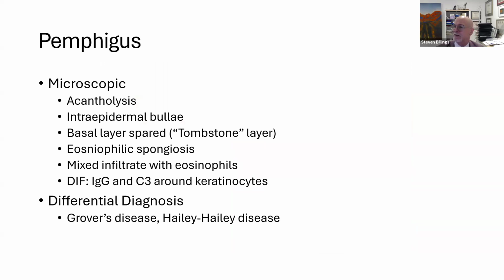Microscopically, you see acantholysis with intraepidermal blister formation, and the basal layer is spared. In other words, the basal layer is still attached to the basement membrane zone, which has been described as creating this tombstone-like layer with the basal keratinocytes sticking up into the blister cavity.